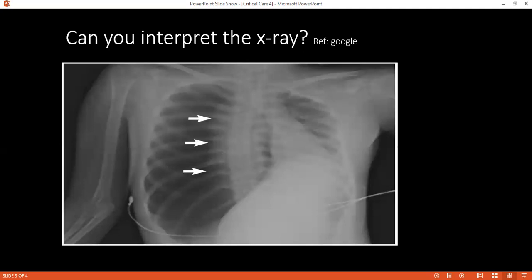Right, tension pneumothorax. How would you comment on the size of the heart and the great vessels? There's cardiomegaly. What about the size of the great vessels? They are also dilated, distended. Very good. Would you say if there is any mediastinal shift or not? Yes, there's mediastinal shift. Right, good.